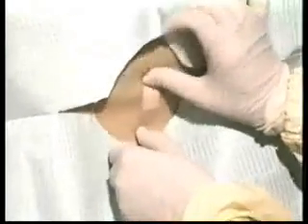Apply pressure to seal the tract and aid hemostasis. Check for bleeding or CSF leakage. Remove the betadine. It can irritate the skin. Apply the Band-Aid. Ask the patient to lie supine for 30 to 60 minutes.